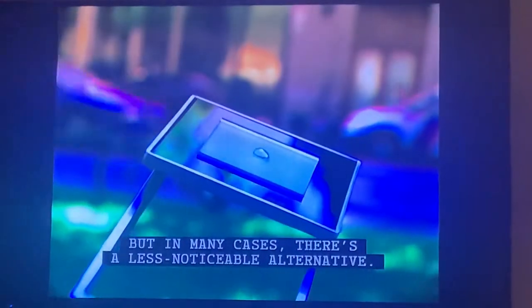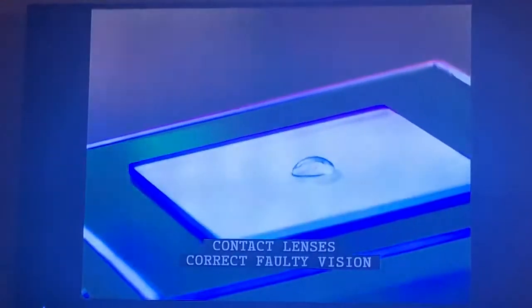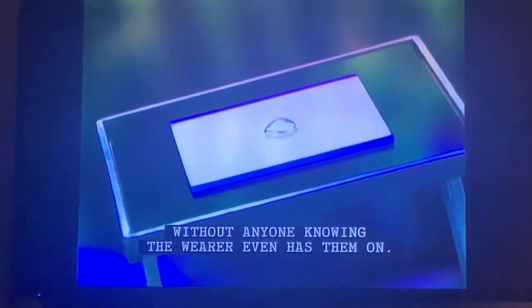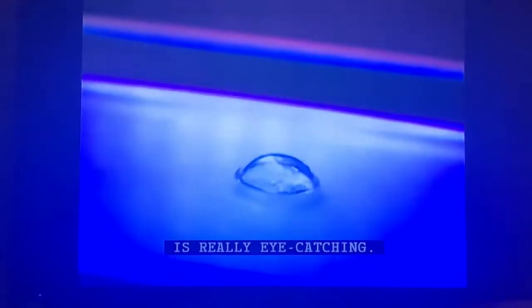People who have defective vision can always wear glasses, but in many cases there's a less noticeable alternative: contact lenses. They correct faulty vision without anyone knowing the wearer even has them on. What goes into making these tiny optical aids is really eye-catching.